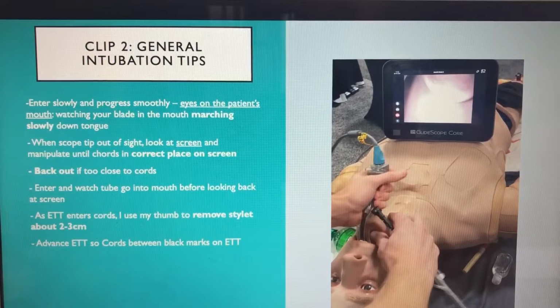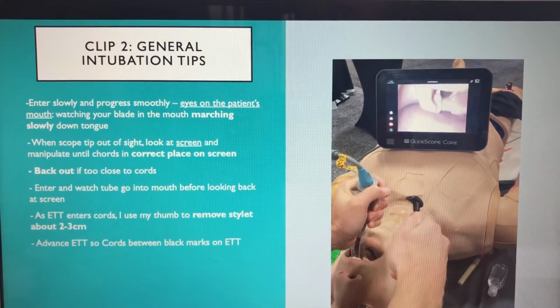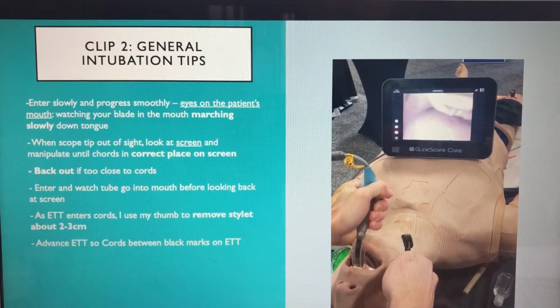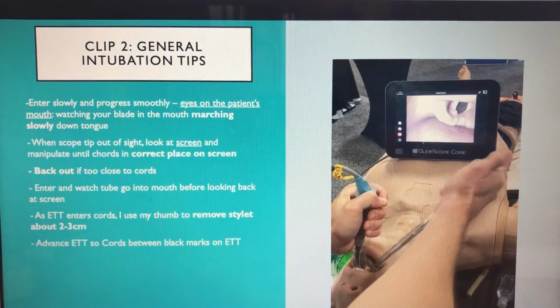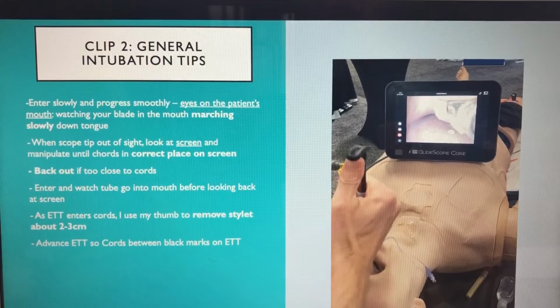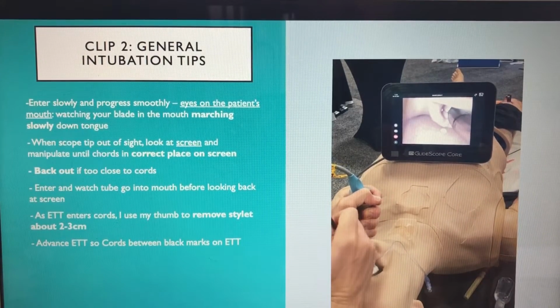You notice that I'm looking at the mouth here, which you can't see, but I am. And now that we're down there, we're going to look at the screen and try to get it in the proper positioning, as we mentioned before. Upper and to the right. And you'll notice that the tube goes right into the right place. If my cords were positioned further to the left, it would not go in that directly. The Glidescope would be in the way.